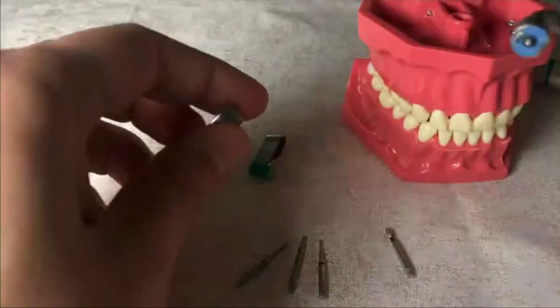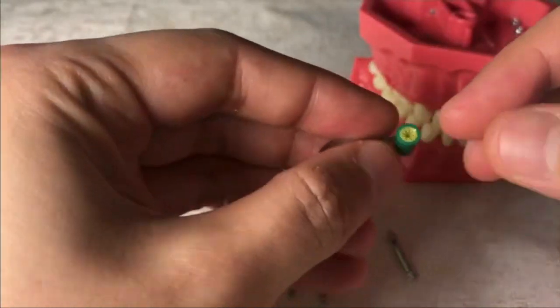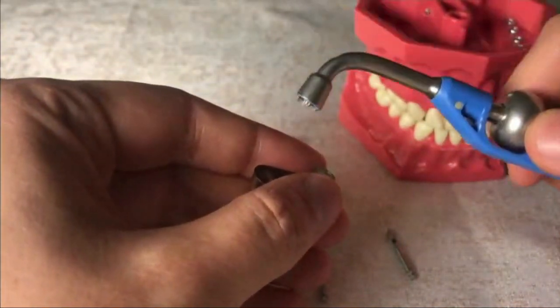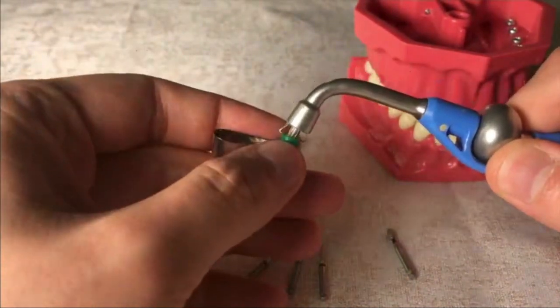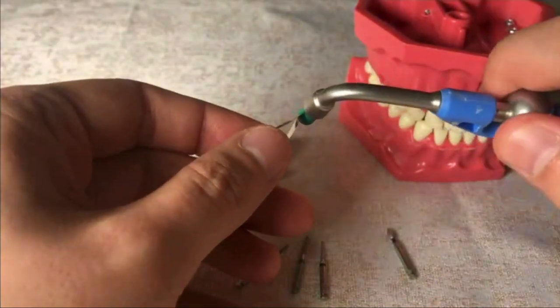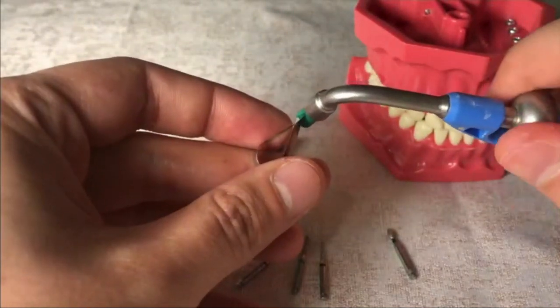You can see the use of the automatrix on the screen. When the ball of the automatrix is pushed, the matrix band is released and the automatrix holds the band by pulling it. By moving the ball onto the right or left, the band tightens or loosens. The purpose of using the automatrix is to prevent damaging the adjacent teeth during the reduction of the axial walls in the preparation.